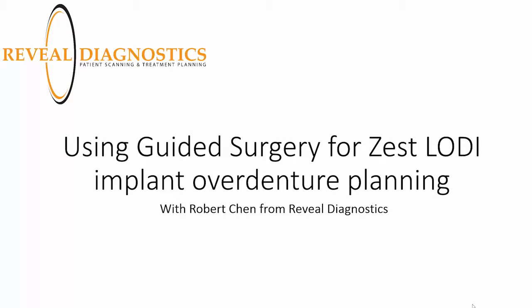If you're new either to cone beam CT imaging or new to the concept of guided surgery, I'd recommend you start by viewing those videos first. They are both available on the Learn LODI channel and have laid down the pieces that we'll be connecting and building off of in this video today.